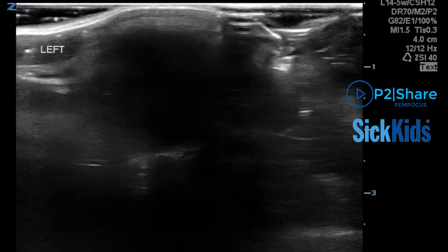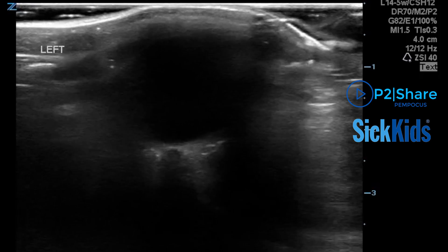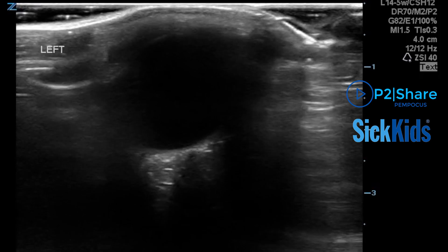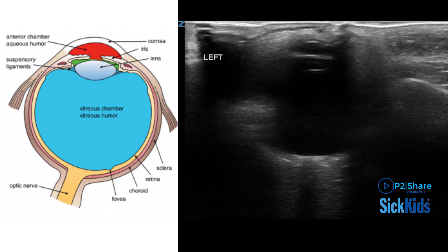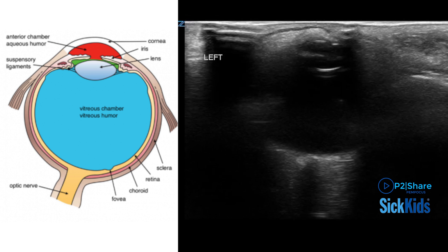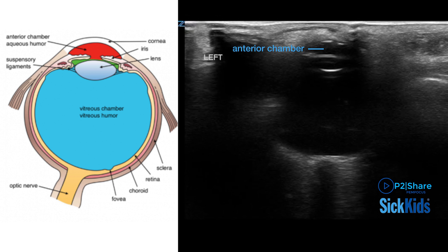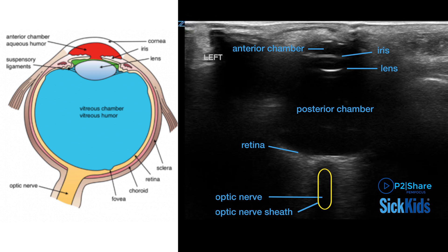When the scan is complete for the initial eye, repeat the transverse and longitudinal views of the other eye. In both views, you can visualize the gross anatomy of the eye, including the anterior chamber, posterior chamber, iris, lens, retina, optic nerve, and optic nerve sheath.